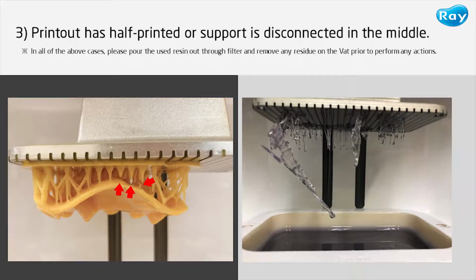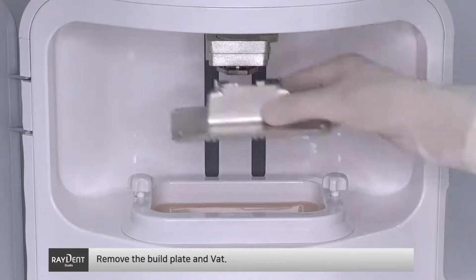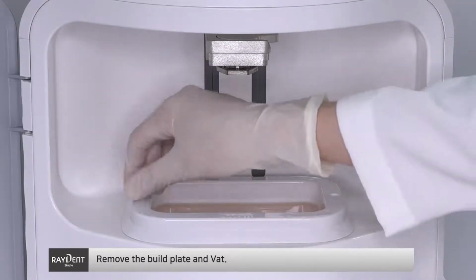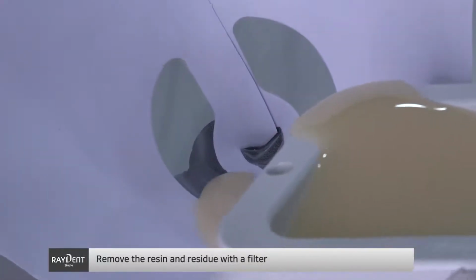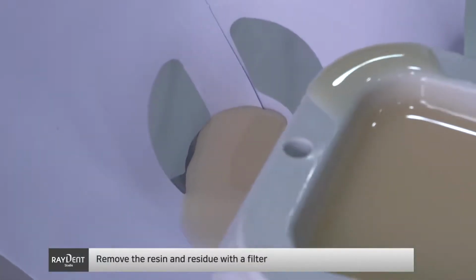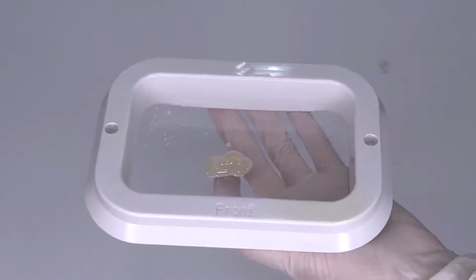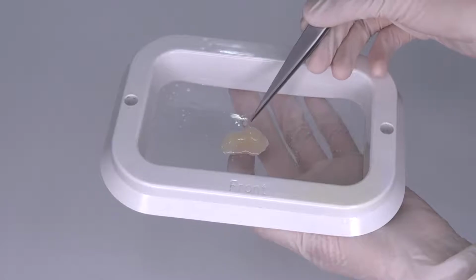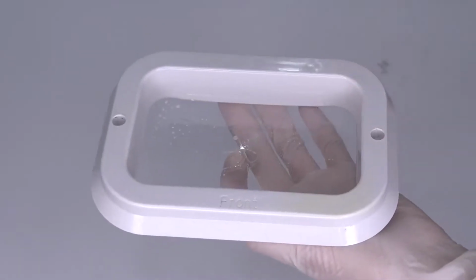Number 3. This is troubleshooting for when the printout has half printing or the support is disconnected in the middle. First of all, in all cases, remove the build plate and the vat from the printer and pour the used resin out through a filter prior to performing any actions. If there's a failed printout attached on the bottom of the vat, slightly rip it off from beneath the vat with a clean finger and remove it with tweezers.